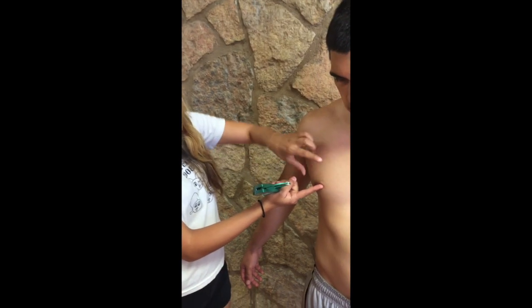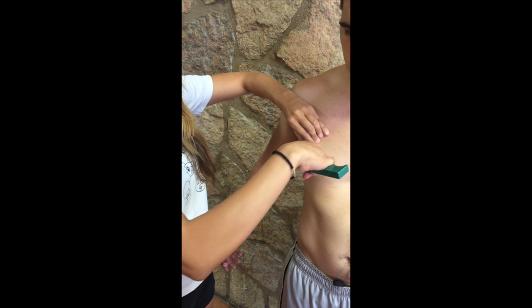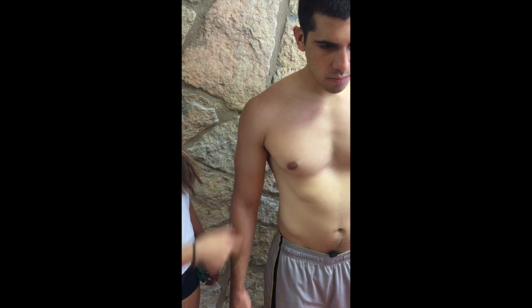The chest is measured using a diagonal fold. When measuring a male, you should measure 1/2 of the distance between the anterior axillary line and the nipple, as opposed to a woman where you measure 1/3 of the distance between the anterior axillary line and the nipple.